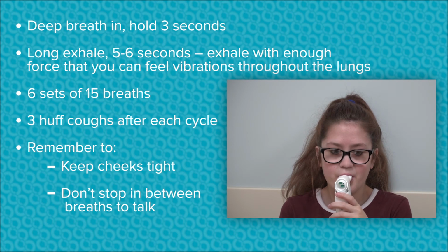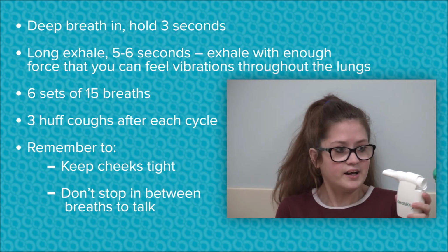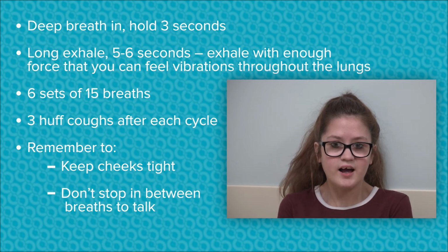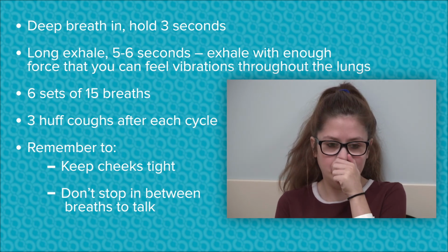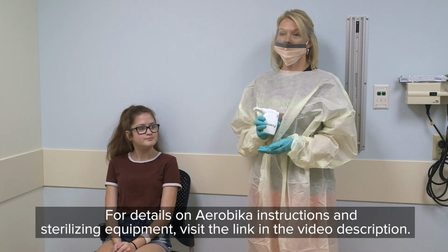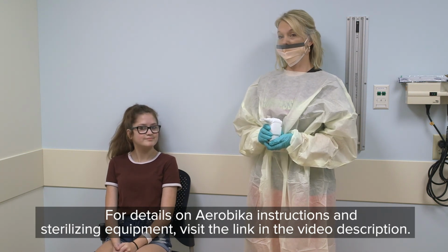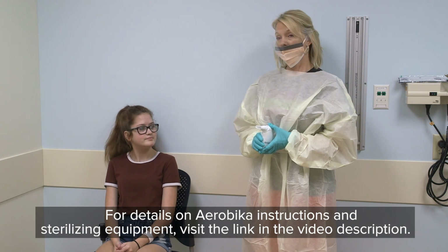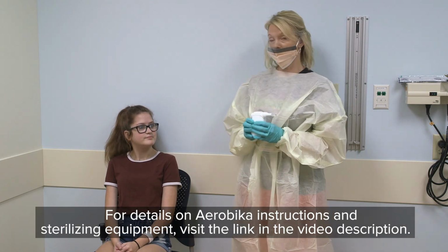Okay. I think that's good. Good job. So after 15 breaths, 3 huff coughs. And of course, if she had any antibiotic or a steroid, that would be given at the end of her airway clearance treatment. But she did a great job with that. Thank you, Sam.